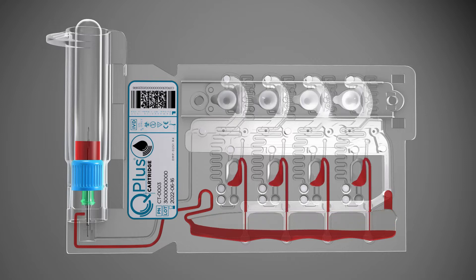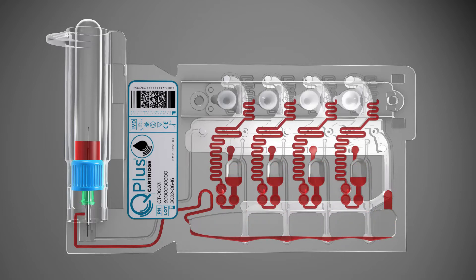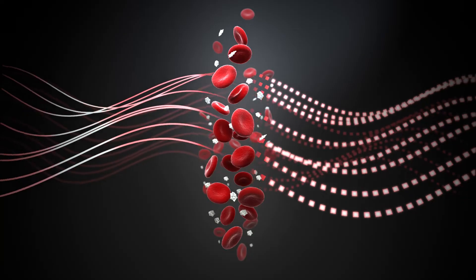The sample is evenly dispersed through four fluidic channels within the cartridge, mixing with various reagents, and then into wells where Quantra's hemostatic parameters are measured. An ultrasound pulse is sent to the blood, causing the sample to resonate.